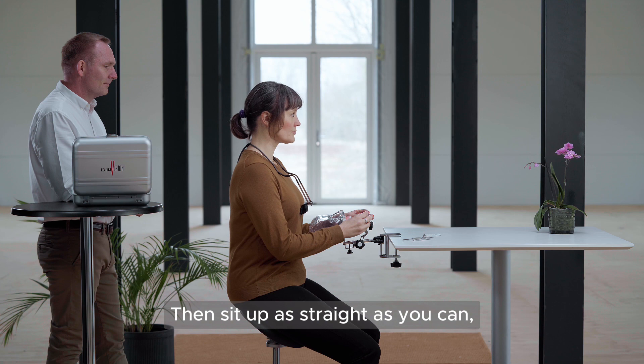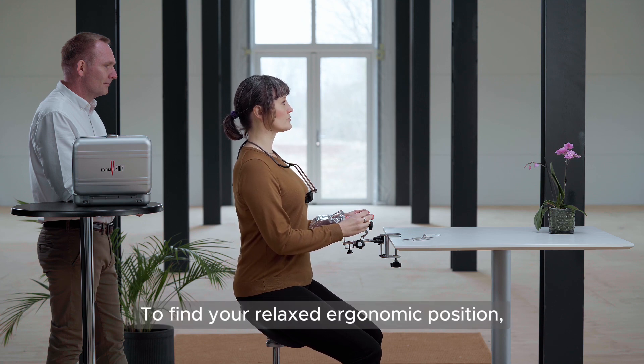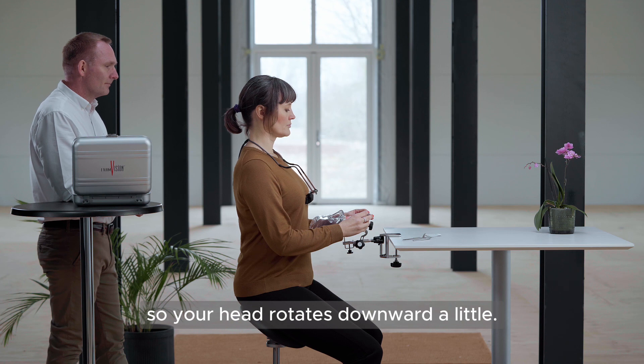Then sit up as straight as you can, looking straight ahead. To find your relaxed ergonomic position, tuck your chin in by about one centimetre, so your head rotates downward a little.